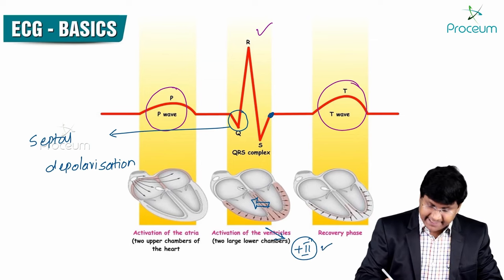You take AVR. AVR is the one which will increase the potential difference across the right arm. You take AVL. AVL will augment the potential difference across the left arm. You take AVF. AVF is the one which will increase the potential difference across the left lower limb. AVF means foot. So your augmented leads are your unipolar leads. And to tell you in detail about the limb leads, what did I tell you? Limb leads are bipolar leads.